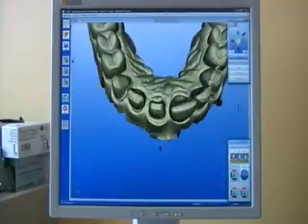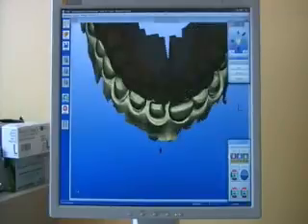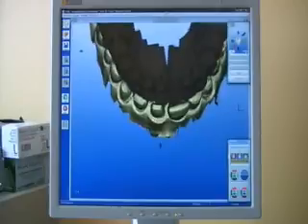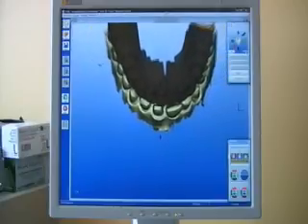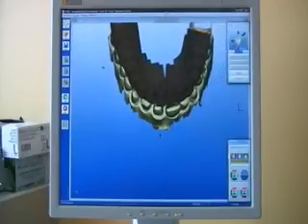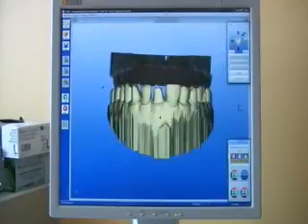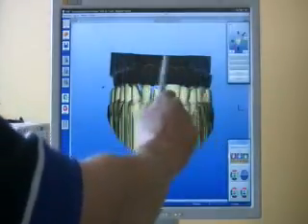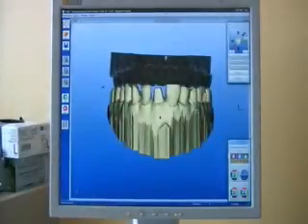The nice thing you see now is that when you do your virtual seat and open up the second program, you hit antagonist. All the changes that we made to our antagonist model in the first steps are there for the subsequent restoration. The next step is to the milling chamber.